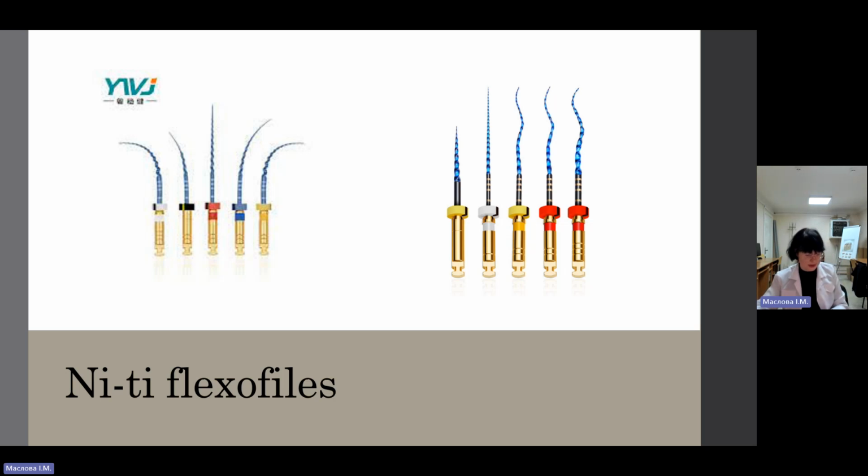In non-vital teeth with ischemic necrosis, the pulp may be extirpated using the same method. However, in teeth with liquefaction necrosis of the pulp, there is usually so little tissue in the root canal that extirpation as such is not feasible. Rather, the tissue remnants will be removed during chemomechanical instrumentation.